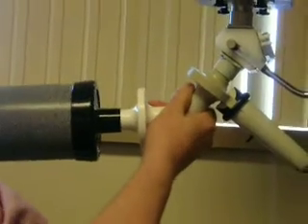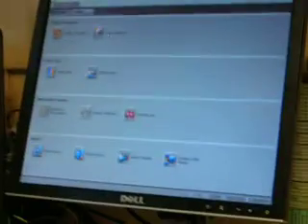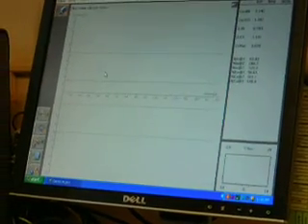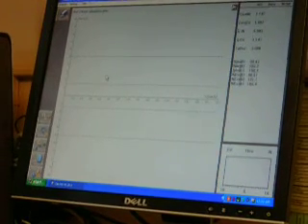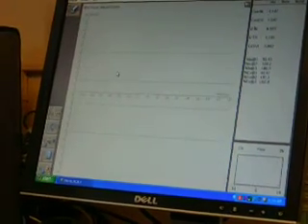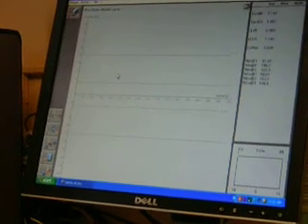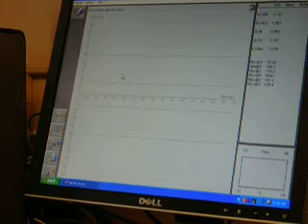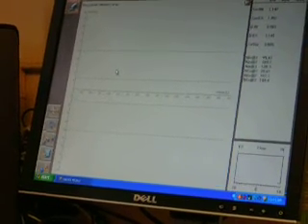Place the syringe on the mouthpiece and the mouthpiece on the system. Click on volume calibration, and it's similar in that it's 3 different flow rates. You want to keep it between the dotted lines. You want to go above the dotted line, between the dotted lines, and between the solid line in the middle and the very small dotted lines in the middle.